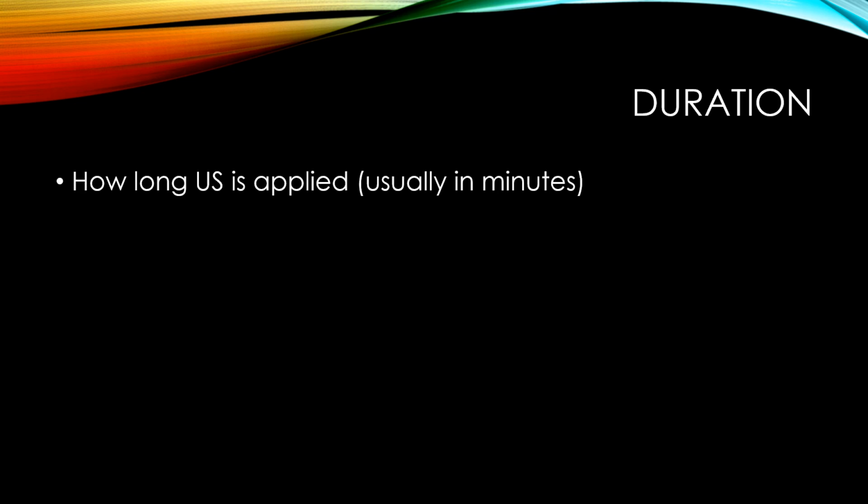Another parameter that the therapist will set when using therapeutic ultrasound is duration. And duration is simply how long you apply the ultrasound. That is set on the machine, and then it will beep usually and turn itself off when you're done. And the duration on your machine is usually set in minutes.